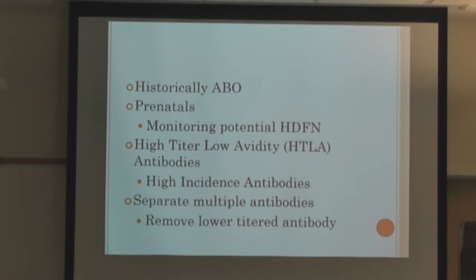And the reason we do that is because I may be a whole lot sloppier than you. I might incubate, because you incubate for 30 minutes, I might incubate for 32 minutes. You might incubate for 28 minutes. So there's variables involved. The cells I pick might be a little bit stronger expression than the cells that you pick. There's all kinds of variables involved. So you want to be able to compare apples to apples and not apples to oranges.